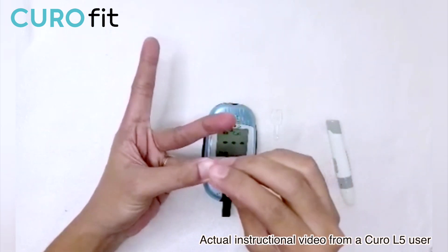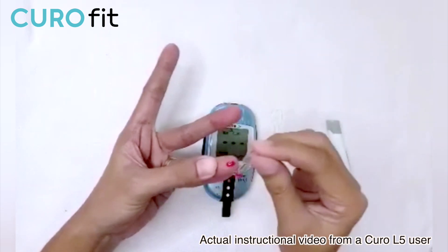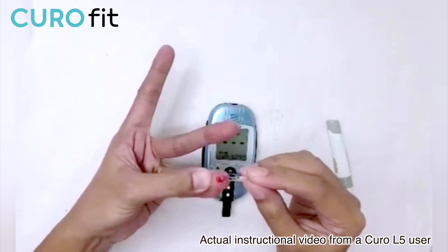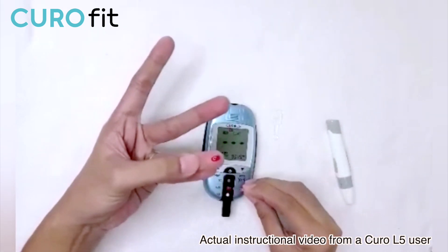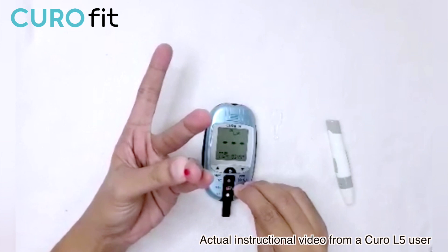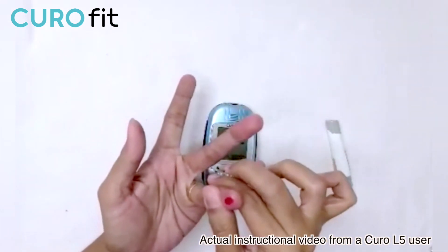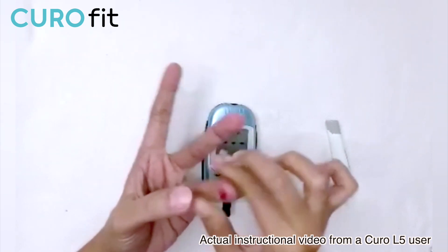For the second blood sample, we need to use a new capillary rod. Same position — finger should be at a 90-degree angle, and when applying, the capillary rod on the test strip should be at a 45-degree angle. Wait for the beep sound before removing the capillary rod from the test strip.